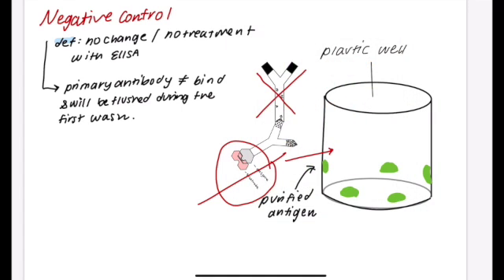So during this wash, during our first step with the detergent, you won't be able to go into the subsequent step of a secondary antibody being introduced to the enzyme or the substrate. And so for our first negative control option, we can simply have no primary antibody being introduced. So we could use a negative patient sample as a negative control.